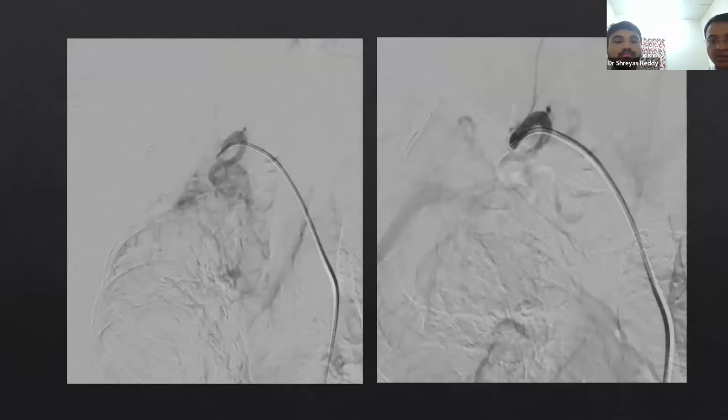Okay, fine. So there is one more thing extra that you have to rule out in this patient. See, you have embolized bronchial arteries now. We have controlled all the systemic and bronchial collaterals. There is one more etiology of bleed in this patient, and what is it? That you need to identify in the CT itself and go and block it.